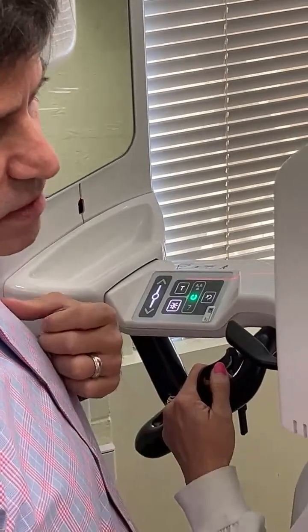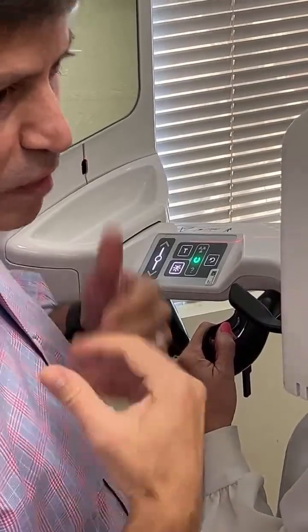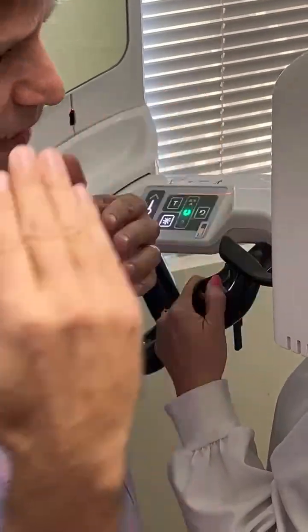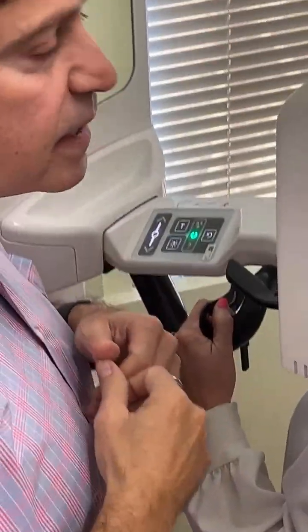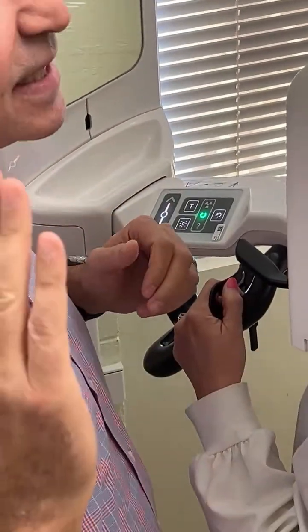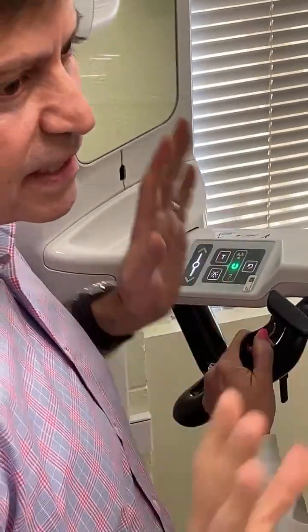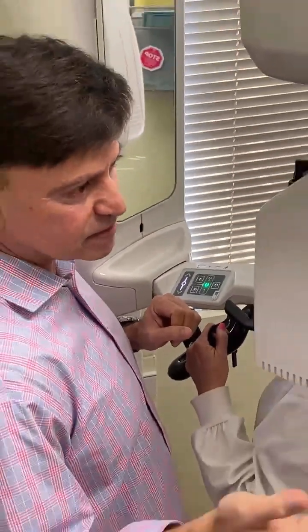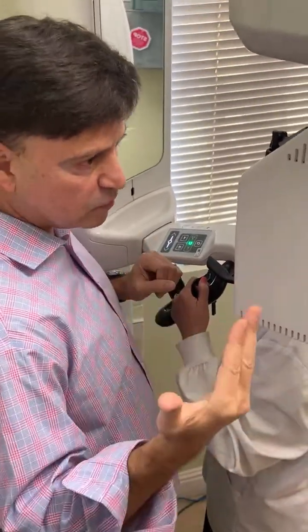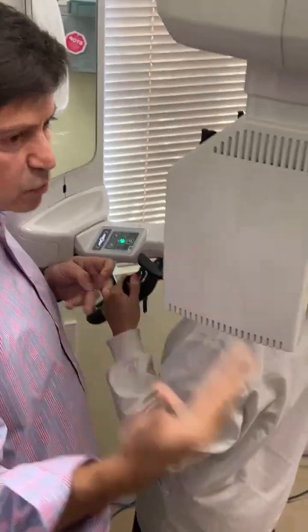So whoever calls 24 hours before, tell Mrs. Johnson that you have an appointment for a pano and we require that you remove all jewelry from the neck up. Everything. Even a nose ring? Yes, even the nose ring, tongue ring, eyebrow, everything out. And if they comply, which is what you're hoping for, then they come in clean. What's going to happen is they're not. So then you're going to have to tell them to remove it, and they're going to argue with you, I don't want to remove my nose ring, but at least you gave them 24-hour notice.